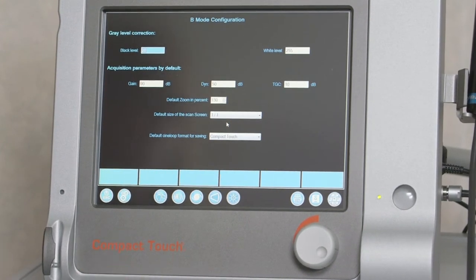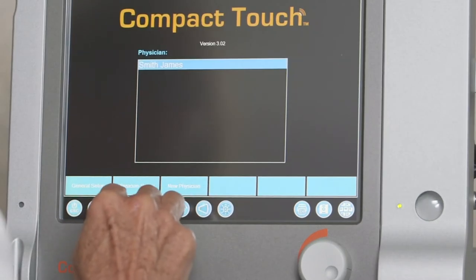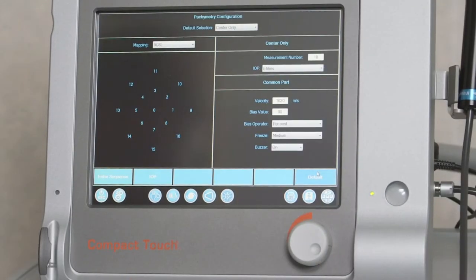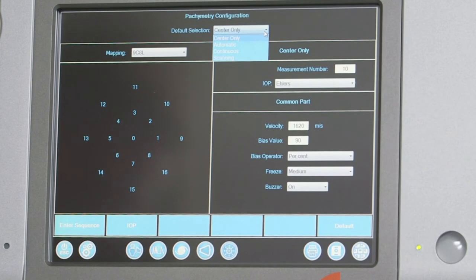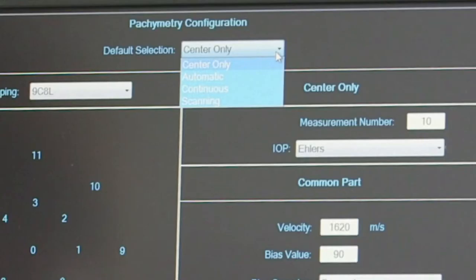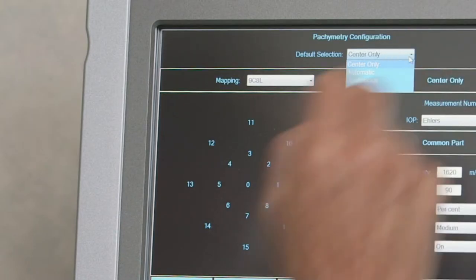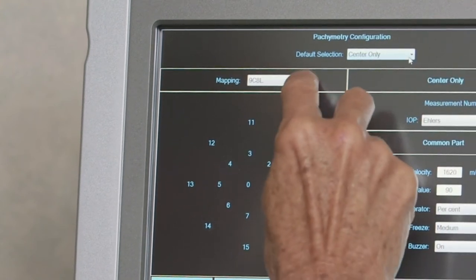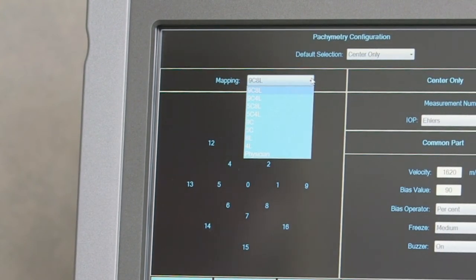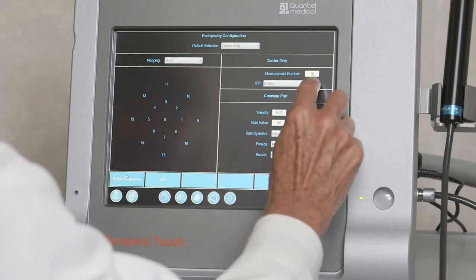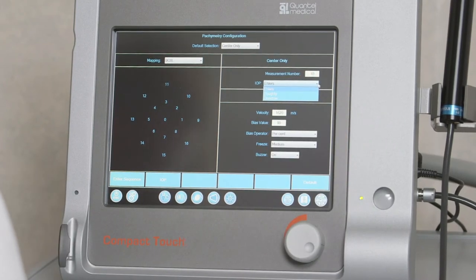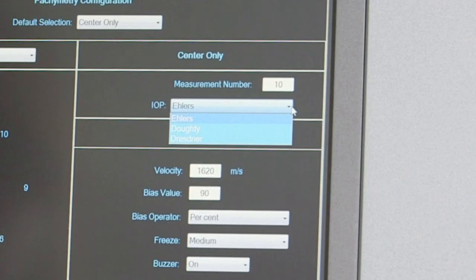Selecting Pachymetry Setup opens the Pachymetry Configuration screen. The Default Selection field allows the examiner to specify the default layout of the Pachymetry Acquisition screen. Four acquisition modes are available – Center Only, Automatic, Continuous, or Scanning. The examiner can also choose from eight predefined mapping sequences using the Mapping pull-down menu. Alternatively, a custom mapping sequence can be created by selecting Enter Sequence from the bottom toolbar. The Compact Touch software provides three correction tables for adjusting IOP – Ehlers, Doughty, and Dresdner – all of which can be viewed by selecting IOP on the right-hand side of the screen.